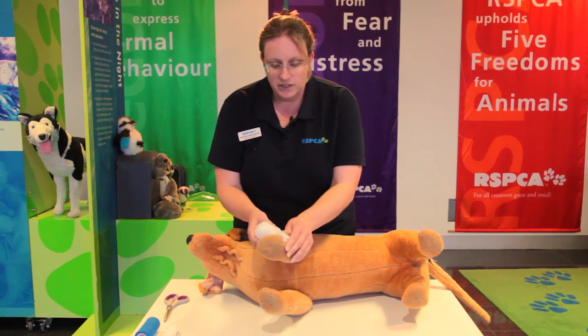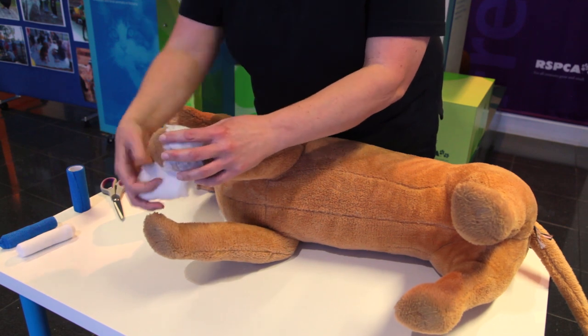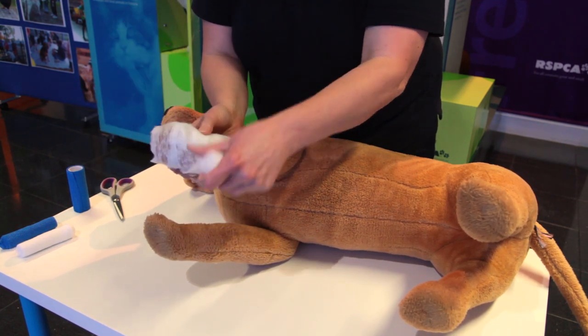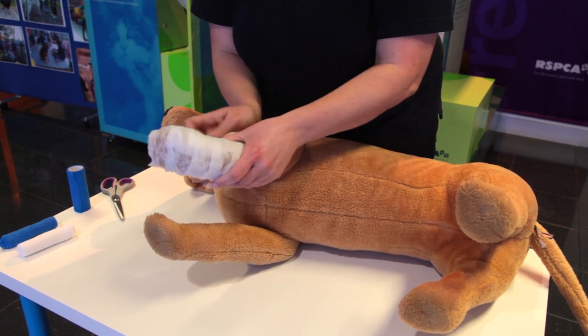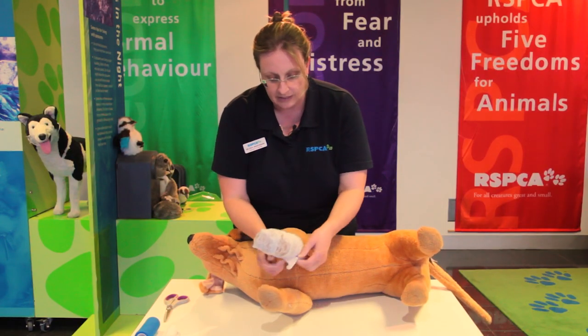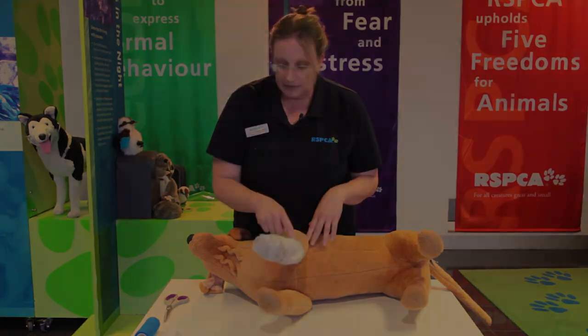This layer doesn't need to be very tight — we secure the dressing in place, roll it around, and always make sure that we include the paw. We roll it around to make sure the dressing is completely covered, going 50% over each previous roll to ensure it's well covered and the pressure is nice and even. Once we finish, we can see that the dressing is covered by the absorbency layer.